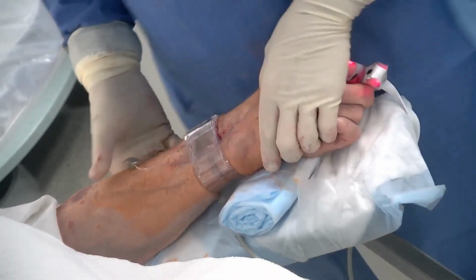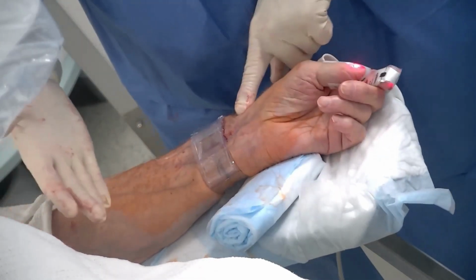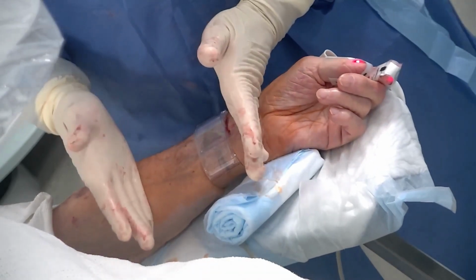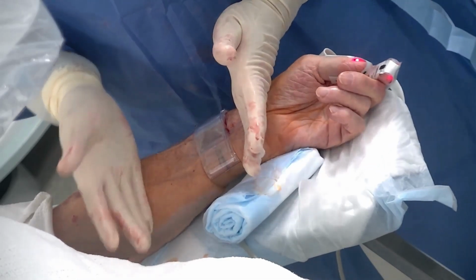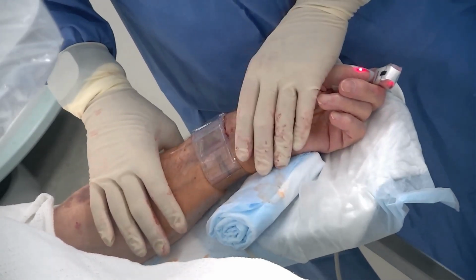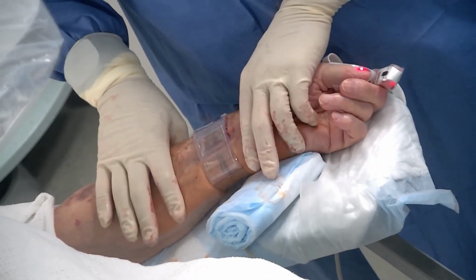And the other thing I wanted to just show you guys, if you look at his wrist, and this is an important point for radial access, here's his styloid, okay? If you look at the distance from the styloid to where the forearm becomes a little bit thicker, we like to sort of go somewhere in the middle between these 2 points when we do our access. This is a little bit lower because we weren't super concerned about his height, but you can go a little bit higher in somebody who's a bit taller. And so we don't really have these height limitations that we used to have, particularly when we use the 130 Penumbra catheter, which has been my favorite as of late, because it gives us sort of the best of both worlds in terms of flexibility, distance to the artery, and all of that.